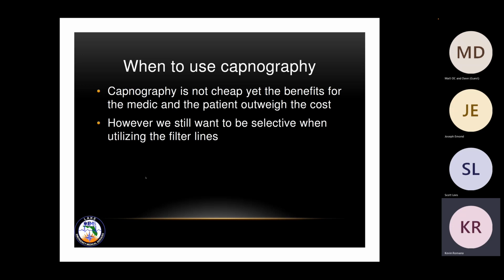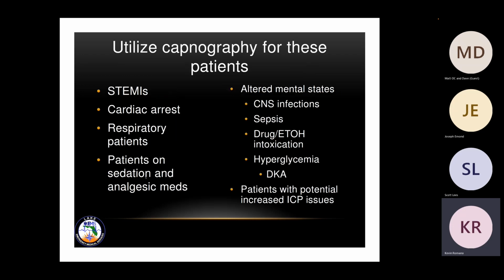I know that capnography is not cheap, yet the benefits for the medic and the patient outweigh the cost. Remember, we can do that at the AEMT level as well. However, we still want to be selective when utilizing the filter lines that are there. Use it when it's needed. Like I said, not every patient needs to have this.